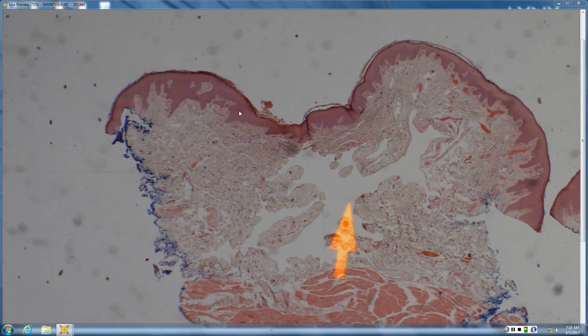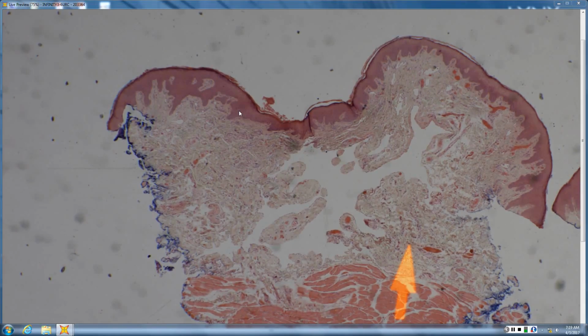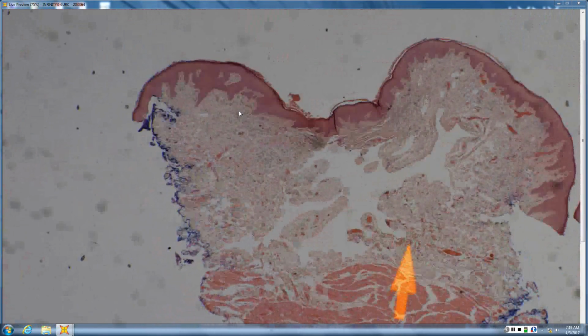So this is just a deeper lymphangioma. The answer is written as lymphatic malformation. Instead of being a well circumscribed collection of dilated superficial lymphatic spaces abutting the epidermis, if not wrapped within it, this is a little bit deeper in the dermis, probably even going a little into skeletal muscle. Lymphatic malformations can go incredibly deep, to the point where you have cystic hygromas and things of that nature.